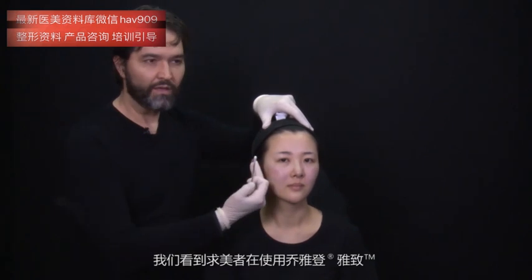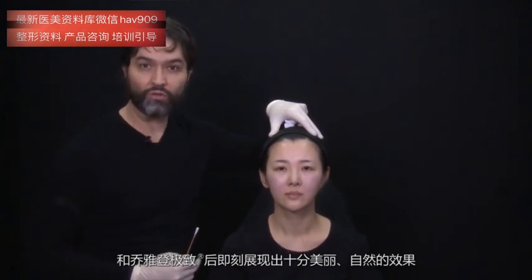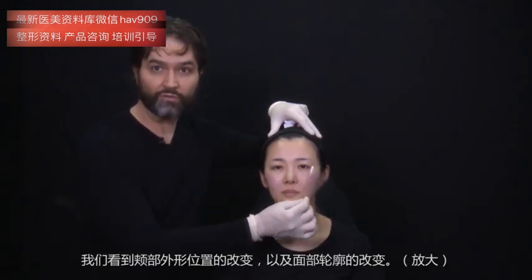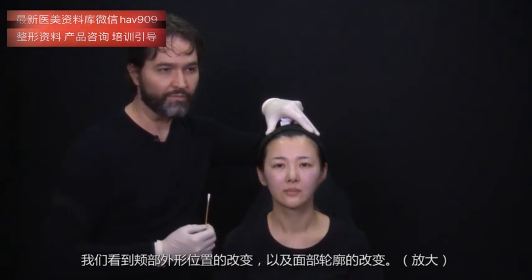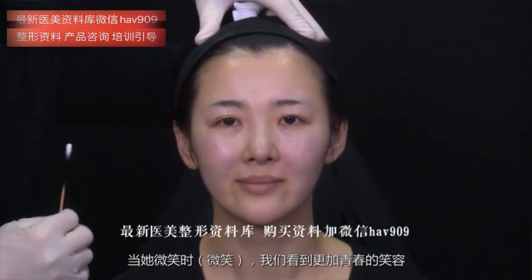We can see a very beautiful and natural result with the patient immediately after we use Juvederm Ultra and Juvederm Ultra Plus. We see the change in the position of the cheek, and we see the change also in the shape of the face. Zoom in. As well as when she smiles. Smile. We notice a younger and more adolescent smile.